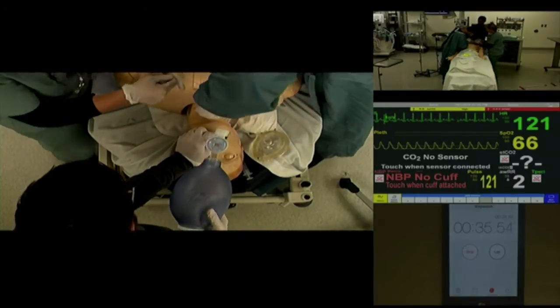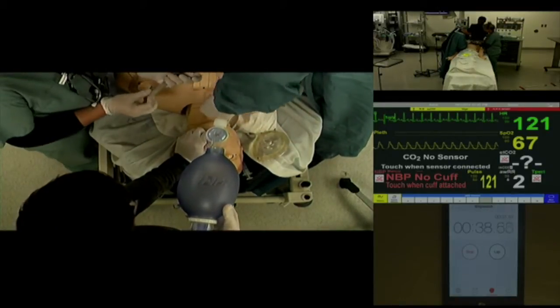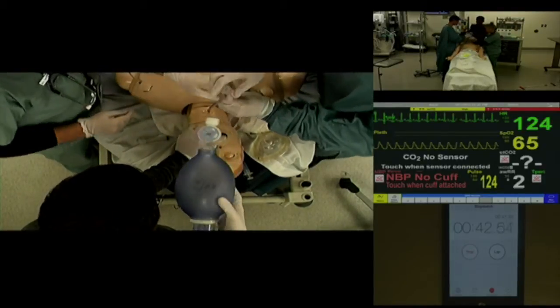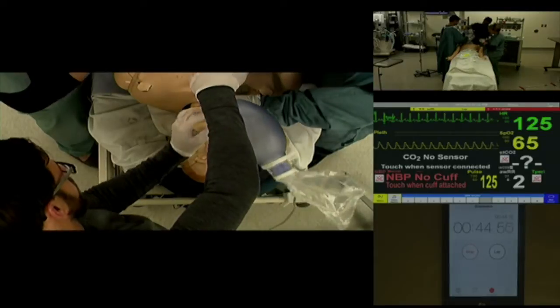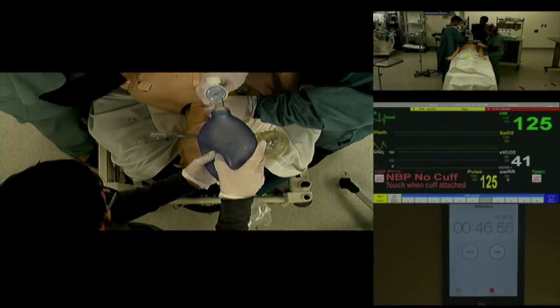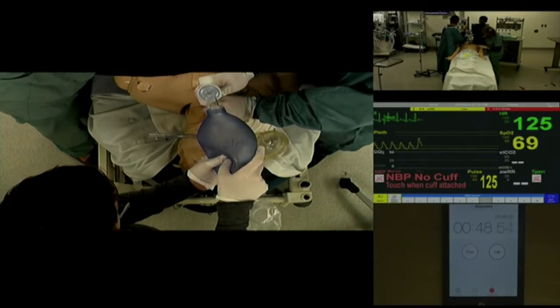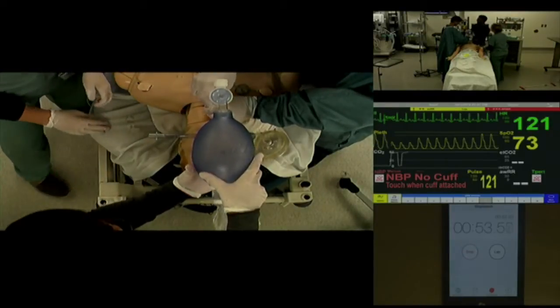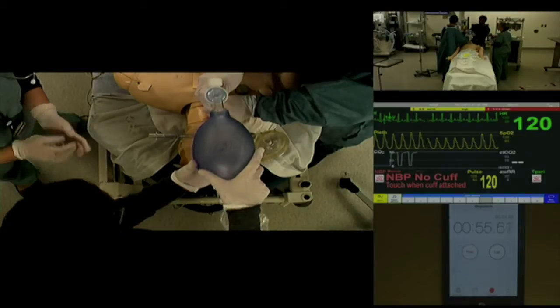Still no chest rise with the LMA. Let's try and bag. Colorimetric — good. Colorimetric — SAT is improving, and end-tidal CO2 is also confirmed. SAT is improving as well.